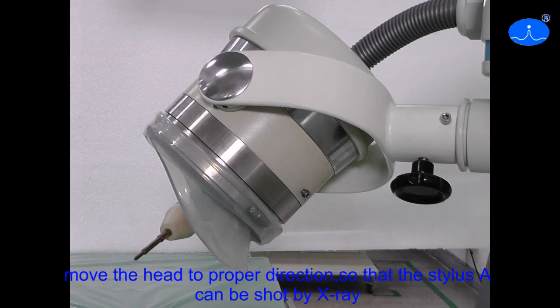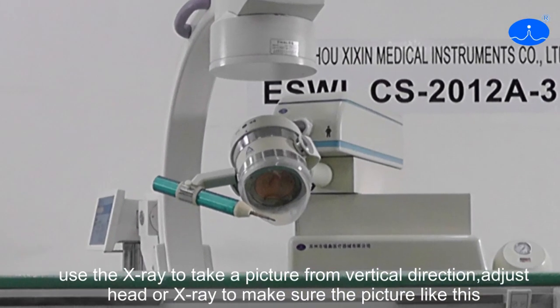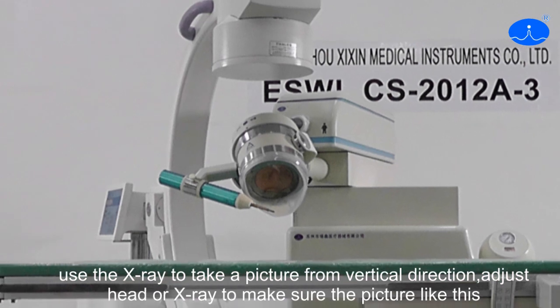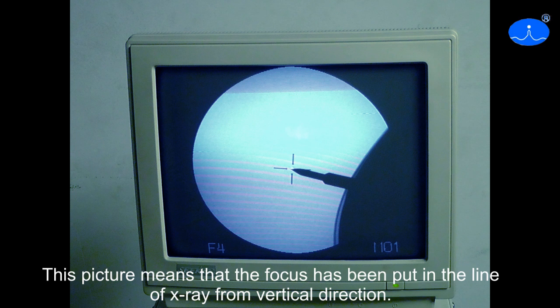Move the head to proper direction so that stylus A can be shot by X-ray. Use the X-ray to take a picture from vertical direction. Adjust the head or X-ray to make sure the picture looks like this. The picture means that the focus has been put in the line of X-ray from vertical direction.